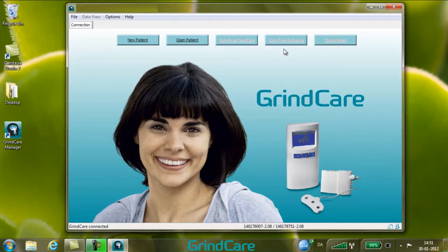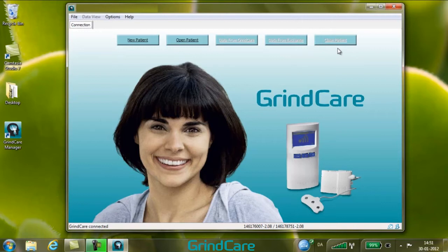Data from Exchange is used for appending patient data from an external file, received by email through the GrindCare Exchange program, to the active patient file. Close Patient closes the current patient file.